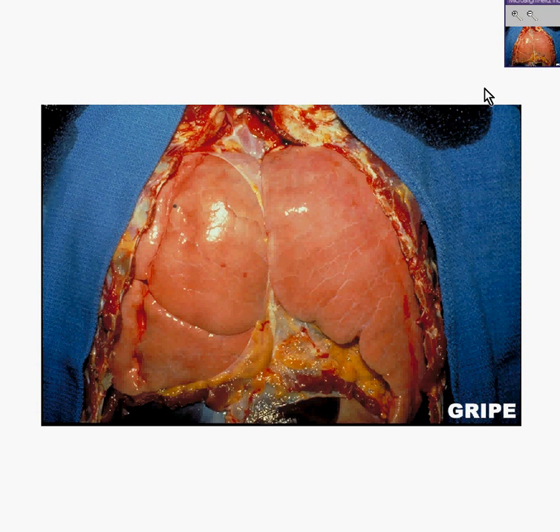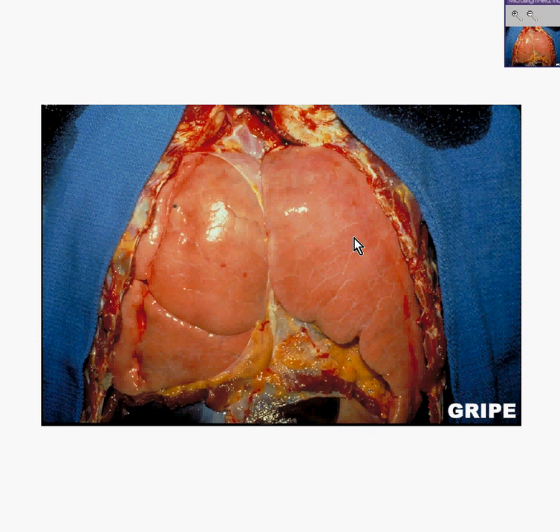Here is another lung viewed in situ, meaning completely within the thoracic cavity. Notice how very shiny and balloon-like the pleural surfaces are. It's almost as if these lungs were over-inflated. The reason why it might appear that way is because the lungs are over-inflated. To help understand why, we'll look at the lung from other points of view as well as microscopically.